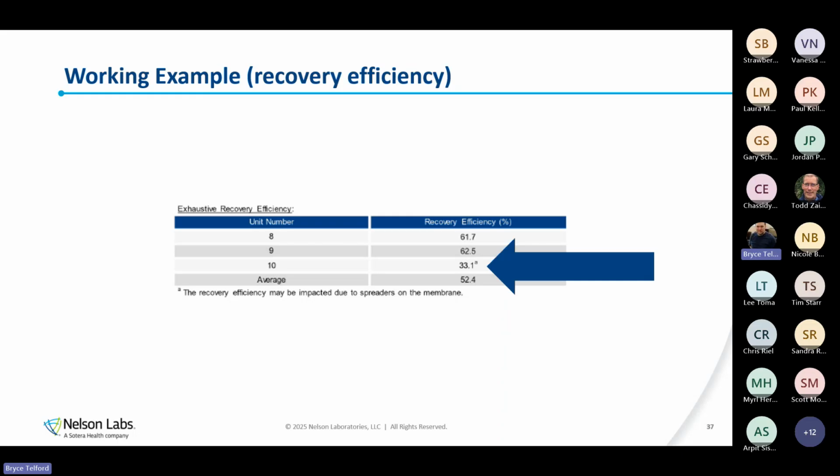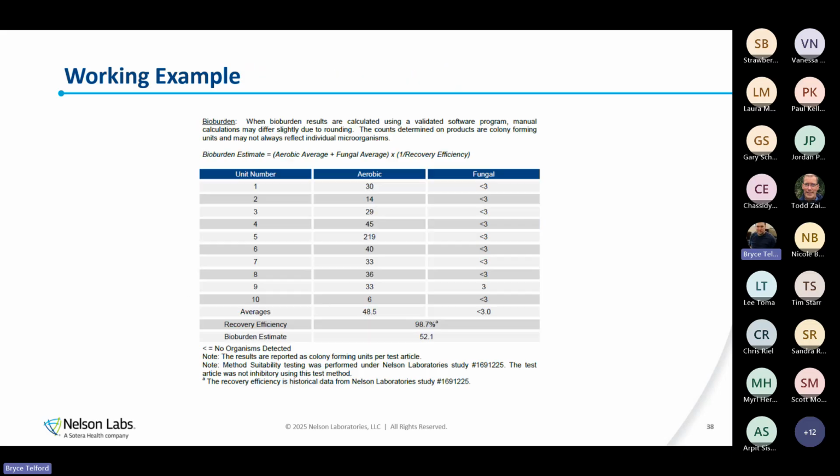But yes, for a bioburden-based method, such as radiation, I need to look at it and give it considerably more scrutiny than I do for my EO and my overkill-based methods. And this is also probably something that you'll even see in your testing data. So I'm going to go to the next slide real quick because it's an example. In your bioburden testing data for radiation, for example, we're generally testing 10 samples. For a dose audit, that is what is prescribed by the standard.